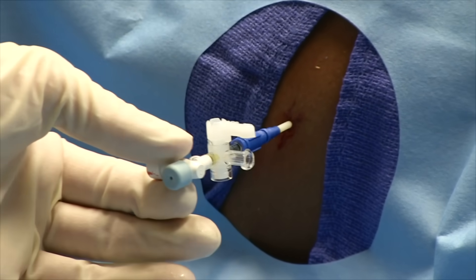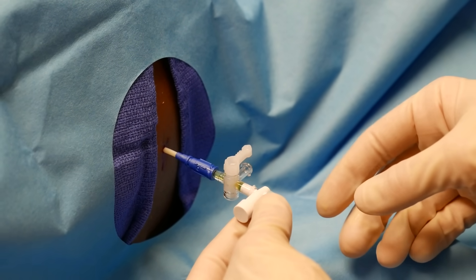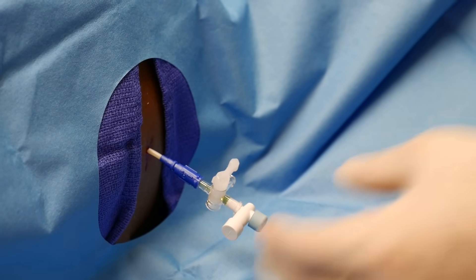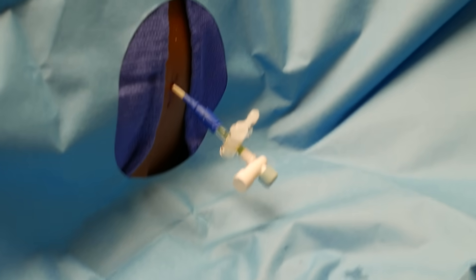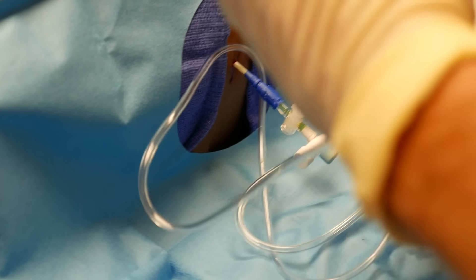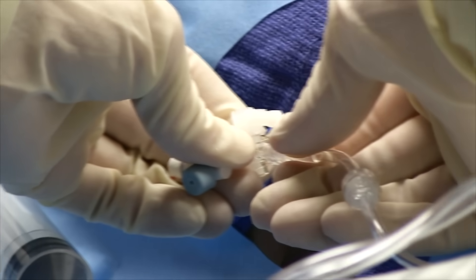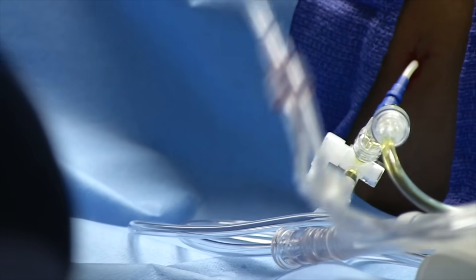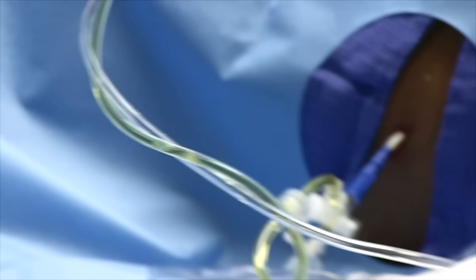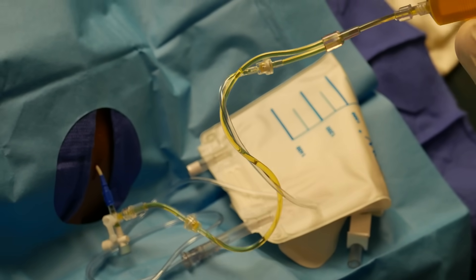Excellent — your catheter is in. Drop your catheter and hook your Luer-lock. The port facing you has a valve. Hook your Luer-lock on your bag and connect it to your stopcock. Now go off towards you — excellent. Now pump the syringe; you should get a fluid return into the syringe. There we go.